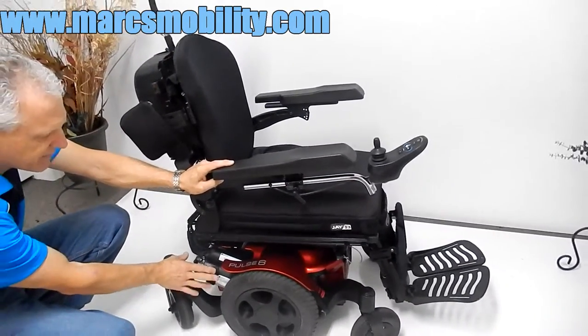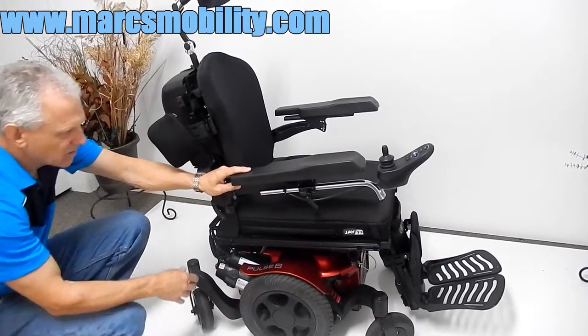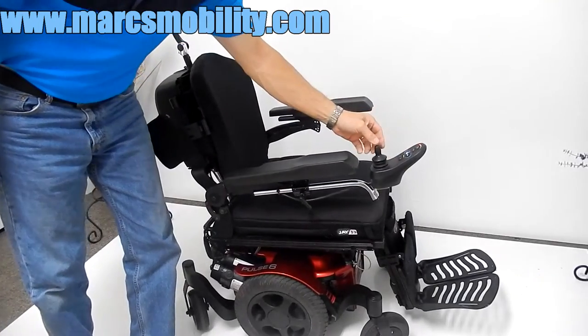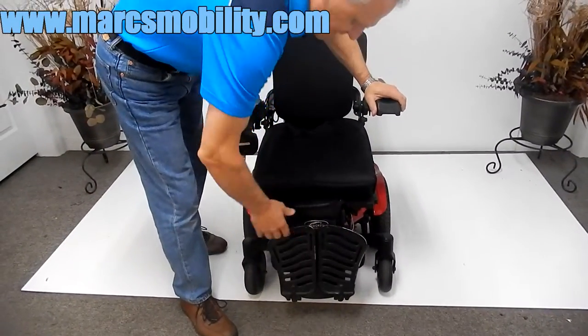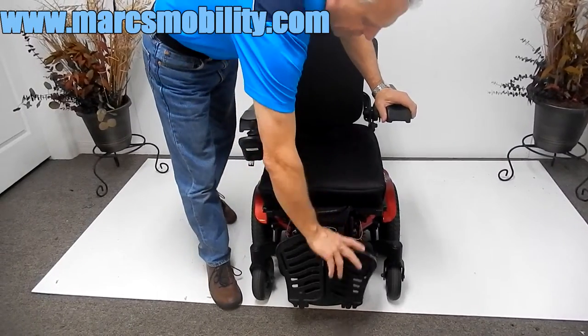Any time you have a four-pole motor, it's better than two-pole motors. Put it back in gear and then you can turn your power back on. I'm going to take it out of mode and put it back in driving position. Also, with this chair you can flip the foot plate up for easy access, and you can bring the leg rests all the way under the chair for easy exit.